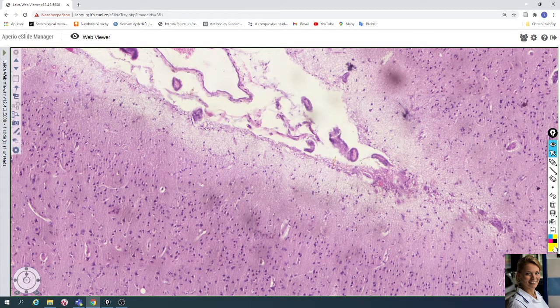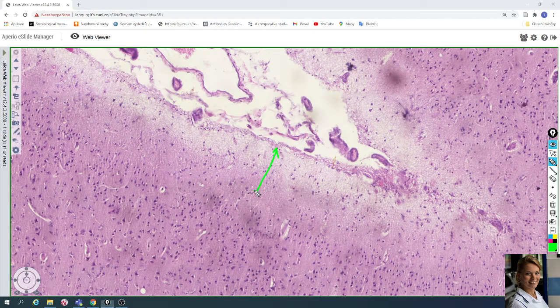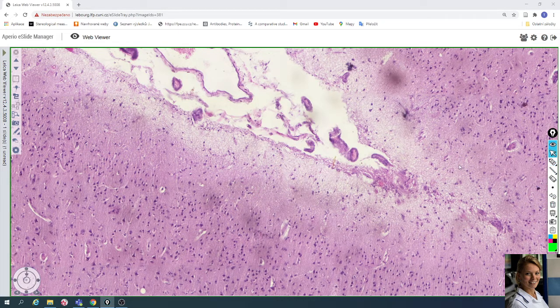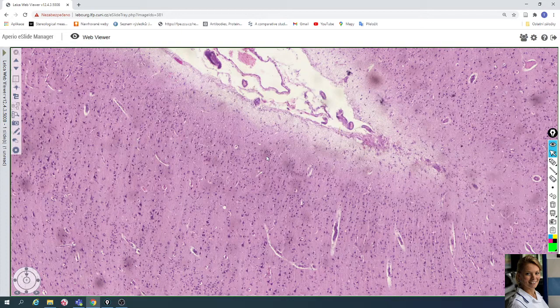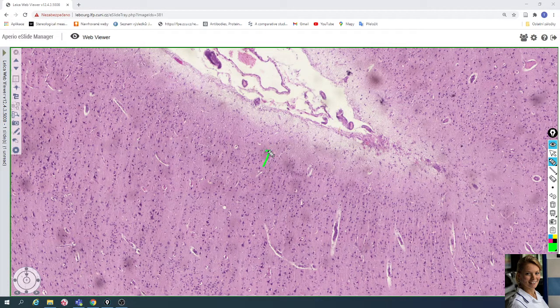The first layer is called the molecular layer — it is a very cell-poor layer of gray matter. This is the first molecular layer. The second layer under the molecular layer is the external granular layer, with predominantly small granular cells, small pyramidal cells, and glial cells.